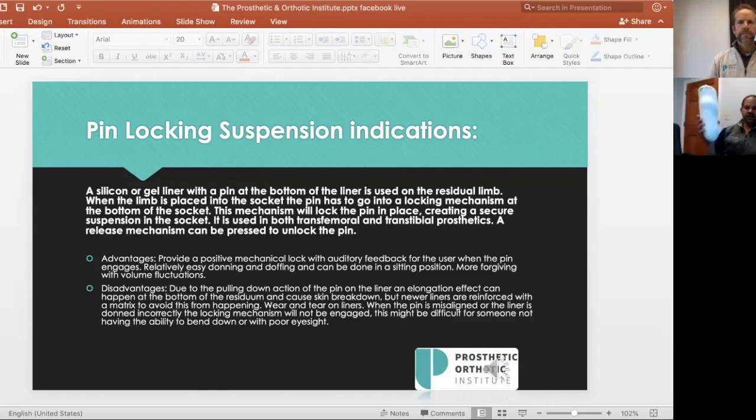I like to describe this to patients as, for example, a balloon with water in it, right? When I squeeze that water balloon, this dissipates the water, gets the fluids out of the residual limb. So you can imagine as you're walking around throughout the day on your prosthesis inside of this closed cylinder, you're pushing those fluids out of the residual limb. When that happens, the residual limb is then relaxed and lying inside the socket, and you've got to make up that space with the prosthetic socks.